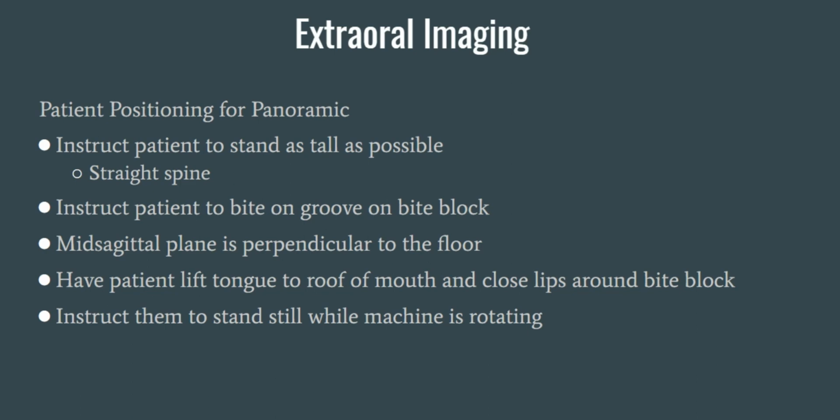Instruct them to stand still while the machine is rotating. And once that rotation has come to a stop, you will be able to have them step out of the machine and remove the lead apron, and then you will be able to go ahead and process that film.